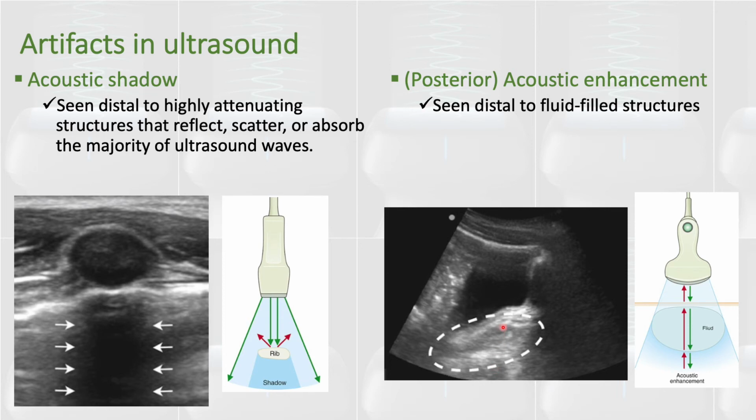So in this case, the artifact is actually diagnostic for the presence of the pathology, and that's why artifacts are useful most of the time, not always, but most of the time during point of care ultrasound or in ultrasound examination in general.